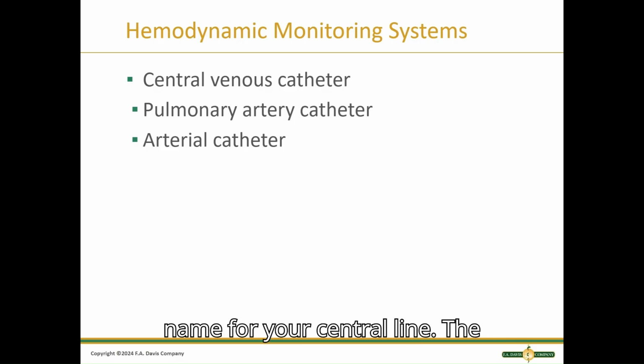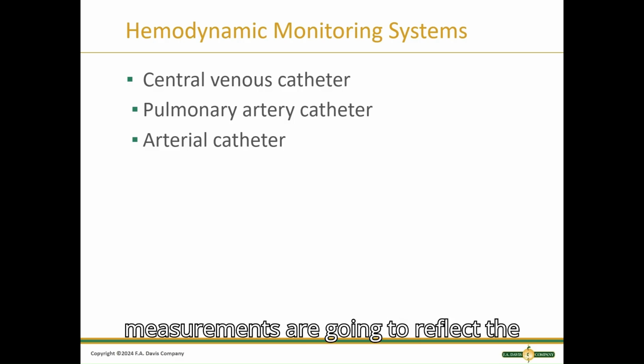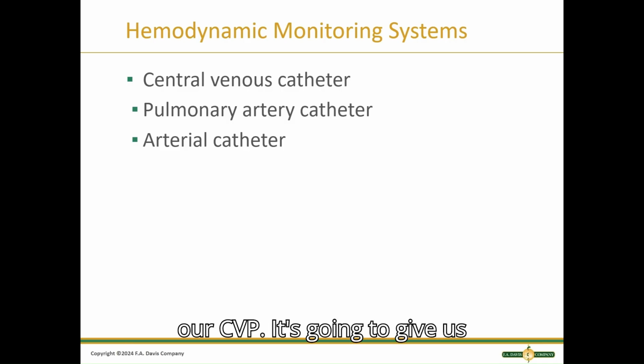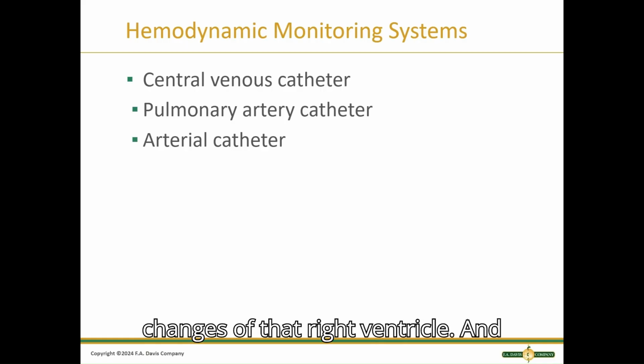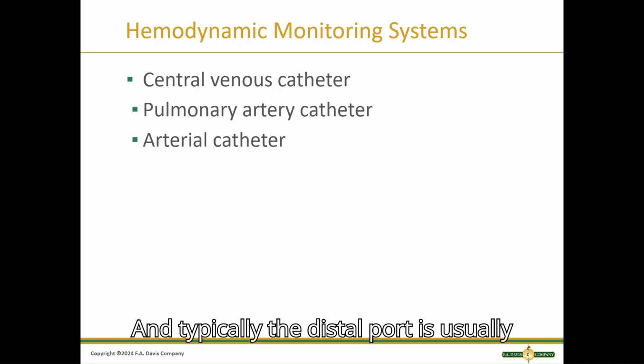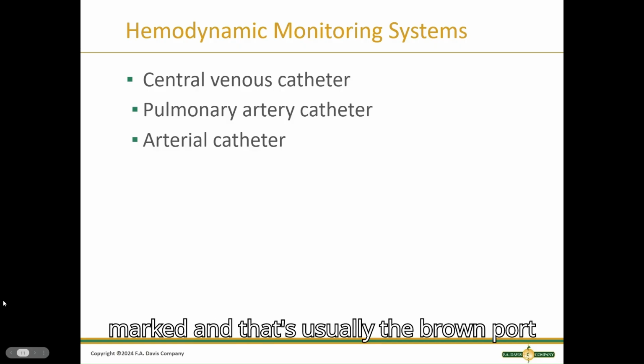It's going to help identify hypoxia, volume status, and we're going to be looking at right and left-sided heart failures. With the arterial lines, we're able to get measurements of oxygenation. We can give medications through some of these and do blood sampling through them. And we'll talk about each one.